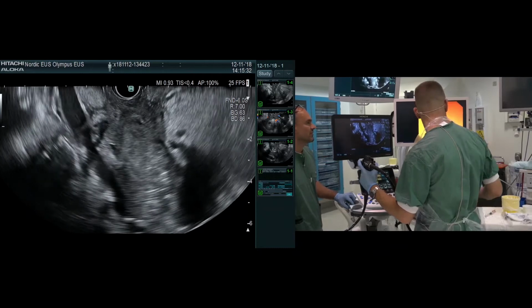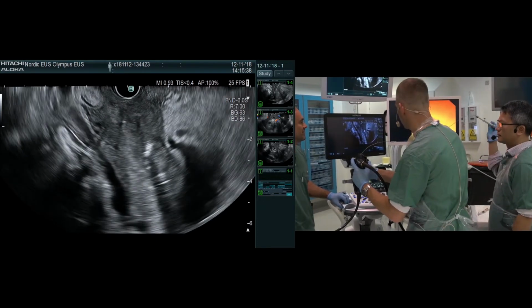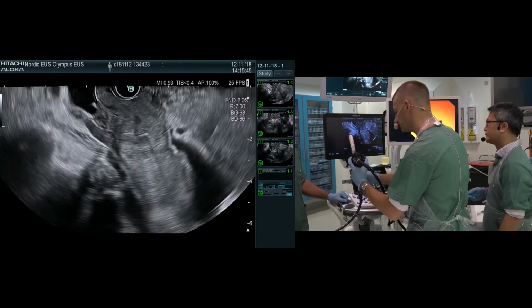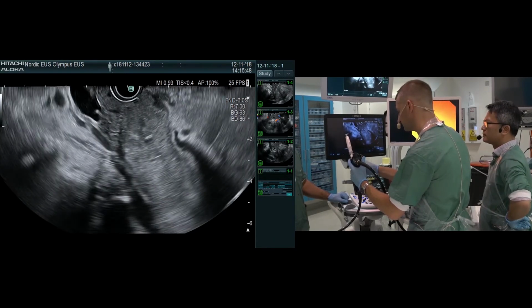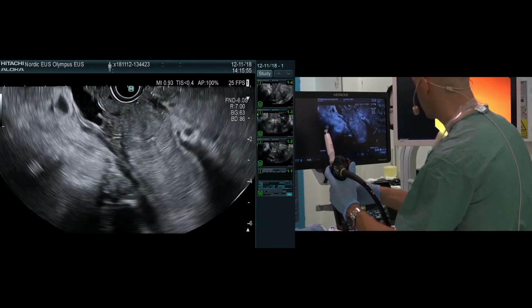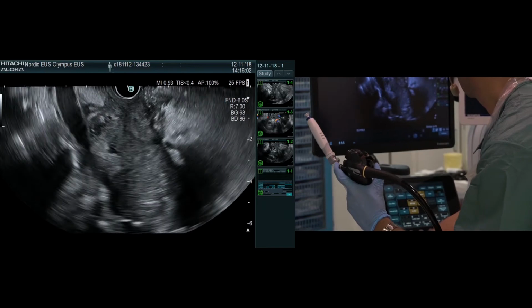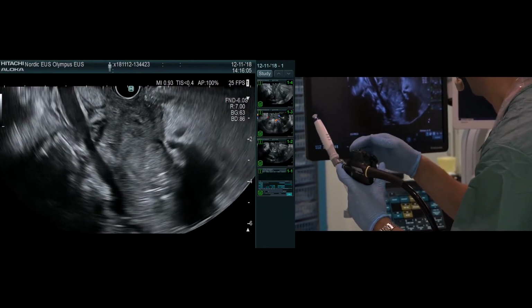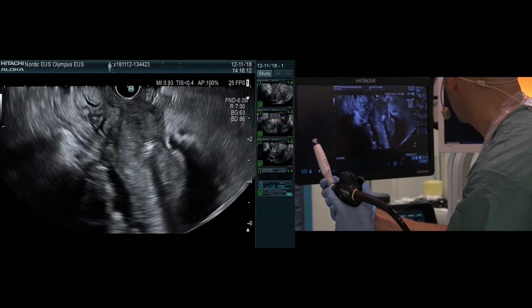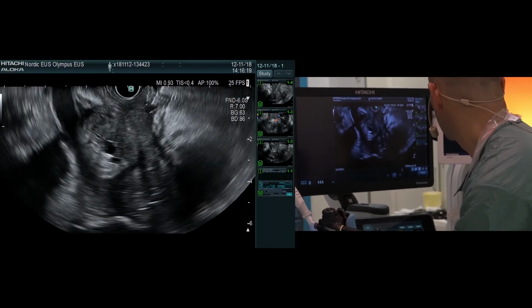Okay. I personally think we should attempt an ERCP first. I mean, we know now that the endoscope can be passed down all the way to the papilla, at least this scope. Is this the Olympus? Yes, because it turns out that I didn't get any material with the Olympus, so we try with another pass. We need to make sure that we are puncturing the tumor, which this probably is. I think in the first pass I probably was not in the tumor, rather in the thickened duodenal wall. I guess this is the tumor. Yes, that looks like it, yeah.